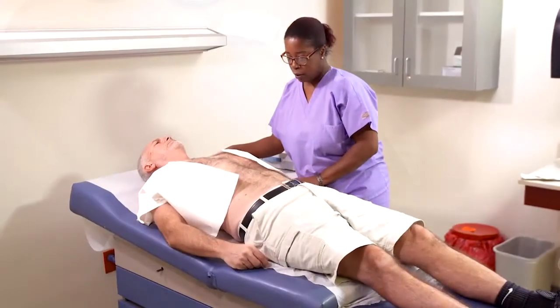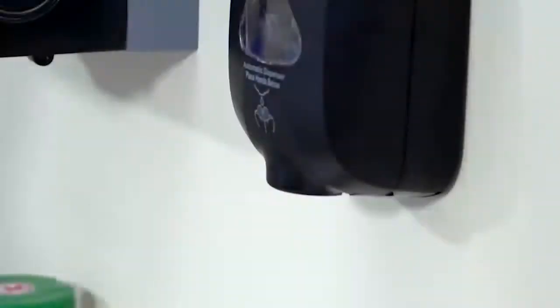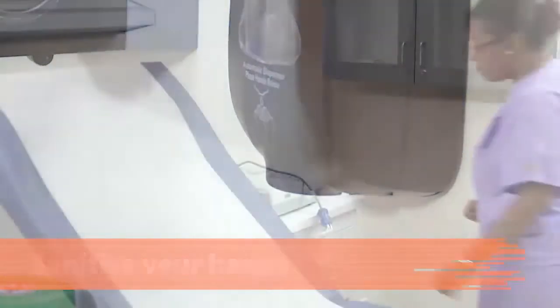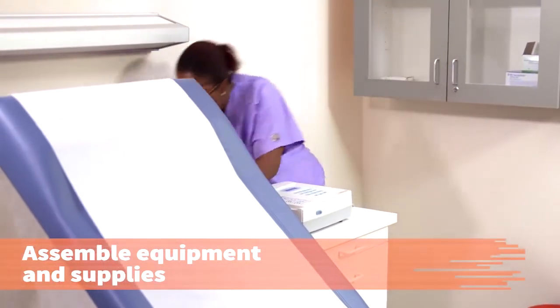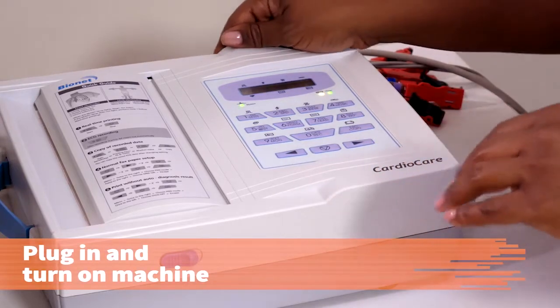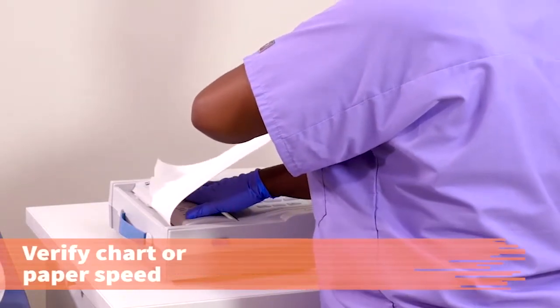In this procedure, you will learn how to perform electrocardiography on a patient. Sanitize your hands before working with the ECG machine. Before the patient arrives, assemble the equipment and supplies needed for the ECG procedure. Turn on the ECG machine if it does not turn on automatically. Verify the standardization and chart or paper speed are correct.